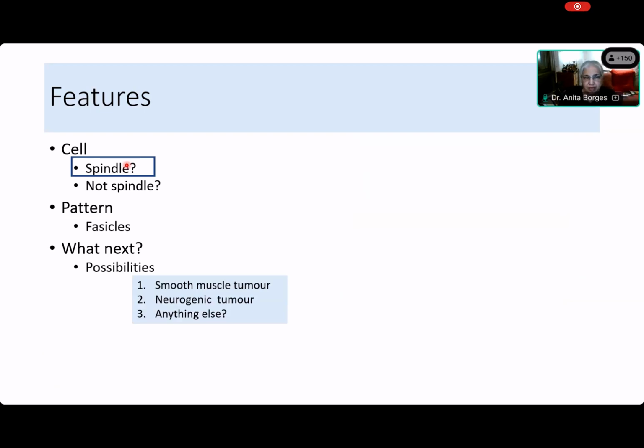Anything else that you're thinking of? No. Right. So now we go to the history. What does the history say? Multiple nodules in the spermatic cord. So what is it likely to be? Do smooth muscle tumors occur as multiple nodules? Have you heard of such a thing? You're a third year student, right? Yes, ma'am. Do you get multiple nodules at any time?